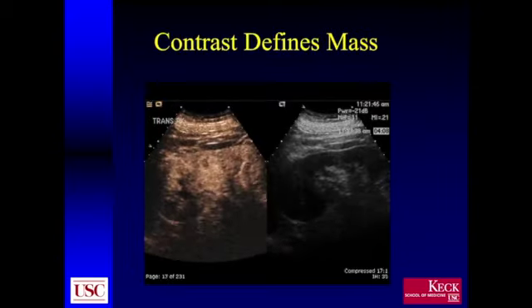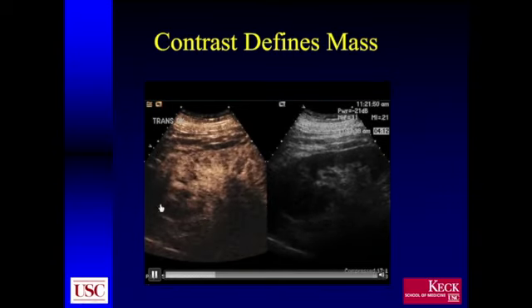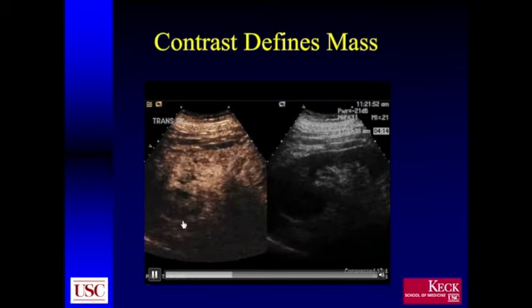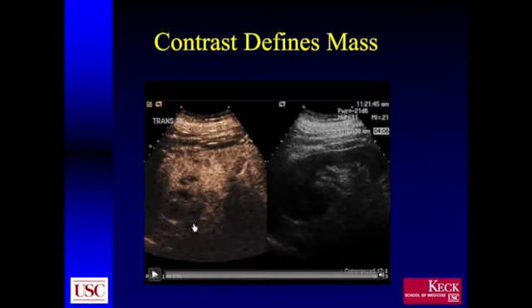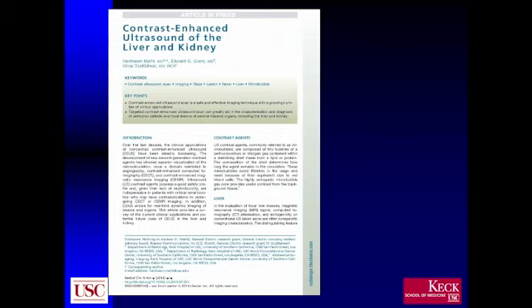And with the injection of contrast, we were able to define this hypovascular area here, and actually were able to biopsy that better after the injection of contrast. There you can see the needle in the lesion. So occasionally, if there is a poorly defined mass, you can define it better. And again, we can use the contrast ultrasound to get a better target and place our needle.